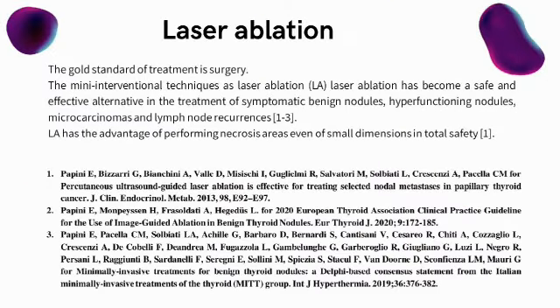The gold standard of benign and malignant thyroid diseases treatment is surgery, but since the early 2000s, mini-interventional methods and laser ablation have taken up more and more space in the treatment of thyroid pathologies. Surgery carries a higher complication rate.